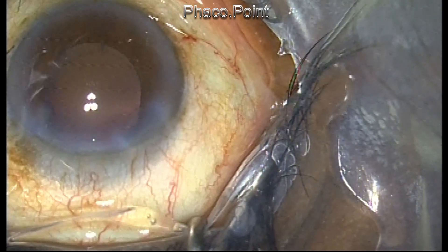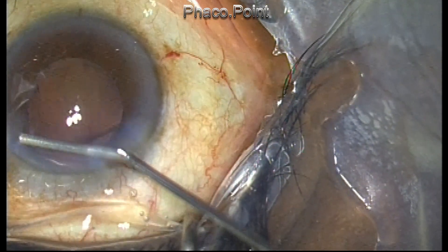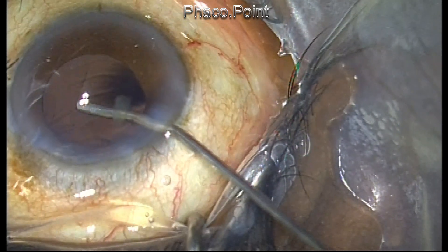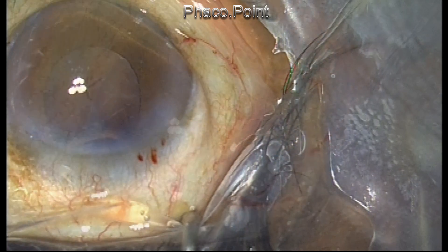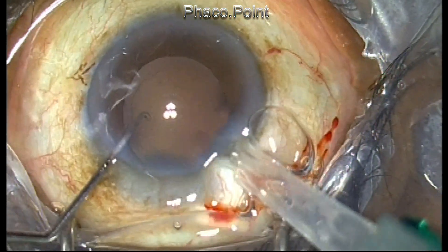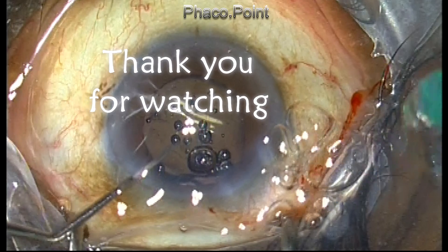A little bit of fragment is floated out of the eye with the help of viscoelastic. There is hardly any cortex remaining in this case, and the IOL is implanted, which marks the end of the case. Thank you for your attention.